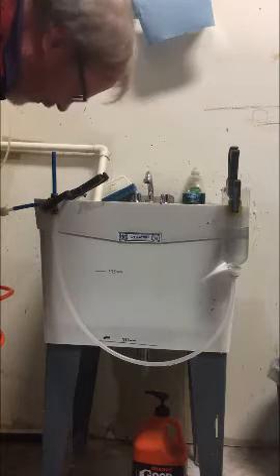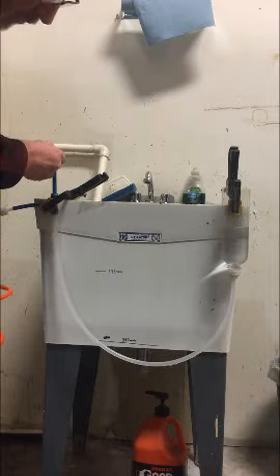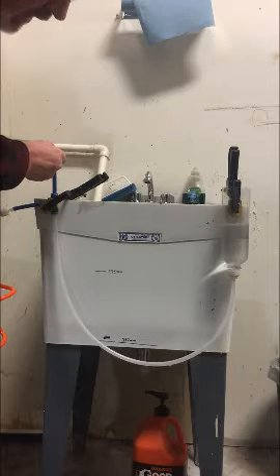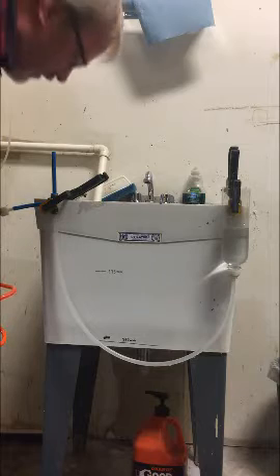Now I'm going to close it off altogether. I don't even have to put my mouth on. I'll just plug it, and you'll see what happens when the pressure exceeds 40 centimeters. It just starts bubbling in the bottle, and then as soon as I relax pressure, the water flows back in and refills the tube.